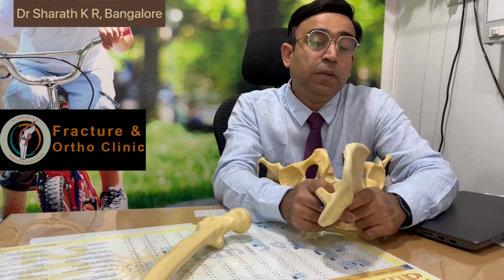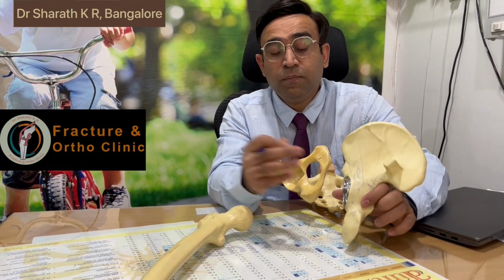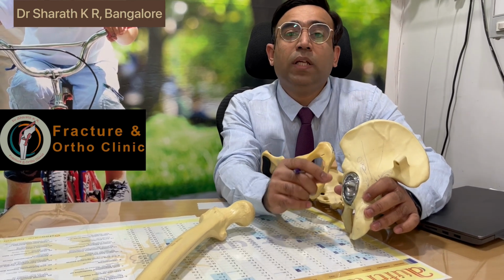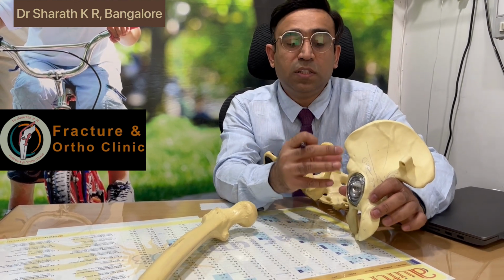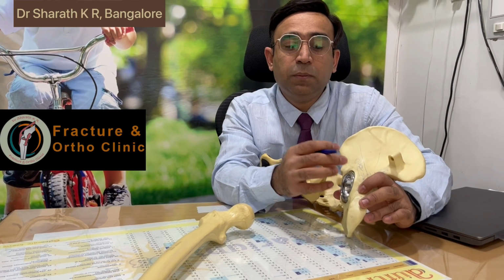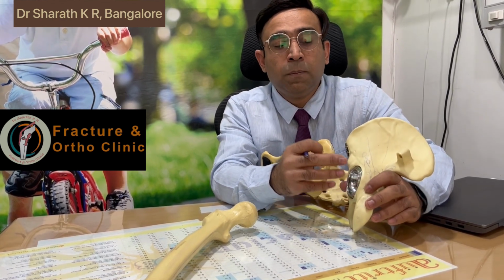Then what is the outcome of hip replacement after acetabulum surgery? The next question. The outcome is reasonably good, good to excellent, depending on the type of initial fracture, depending on the bone quality, how best we put the implant, and how we plan these surgeries and arrange for specific implants, meaning augments. Sometimes we put augments, meaning some type of blocks in different shapes, which will help in recreating the acetabulum.